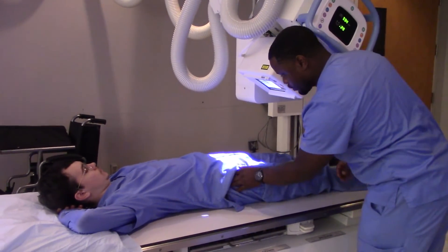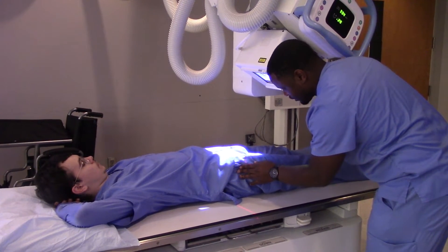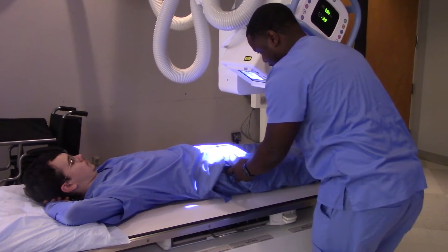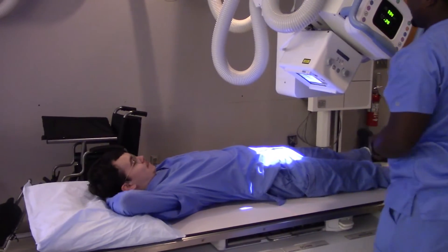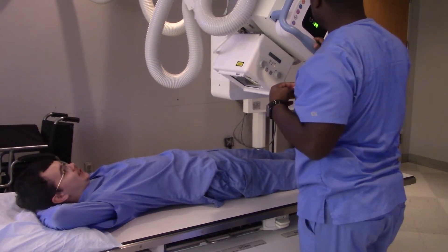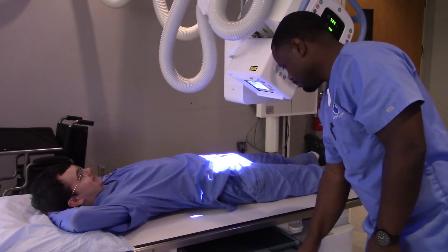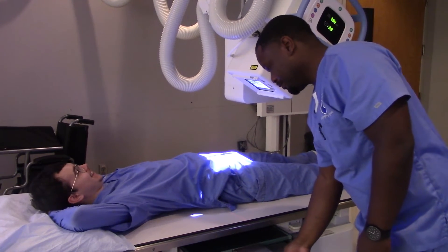I'm going to feel for the greater trochanter here. The plan is to find the greater trochanter because that's at about the same level as the pubic symphysis. We could just grab the pubic symphysis, but that might make somebody uncomfortable. We don't want to go doing that.